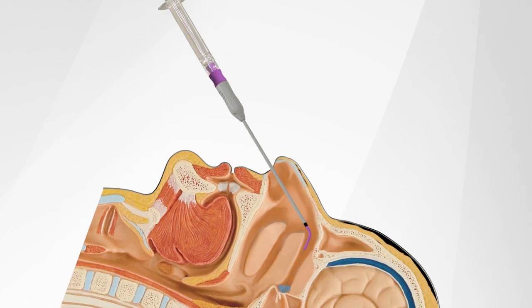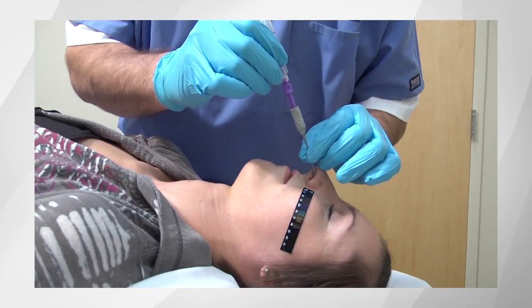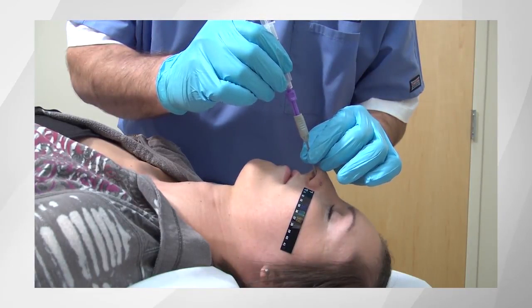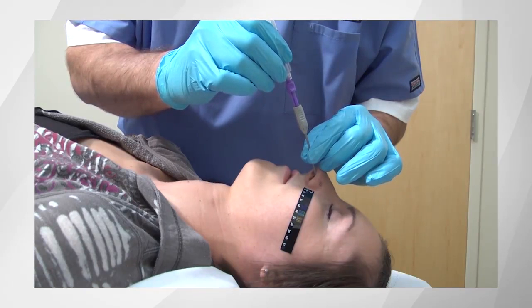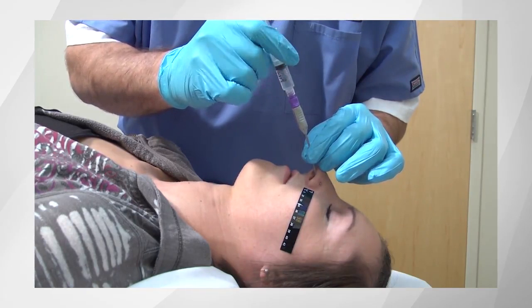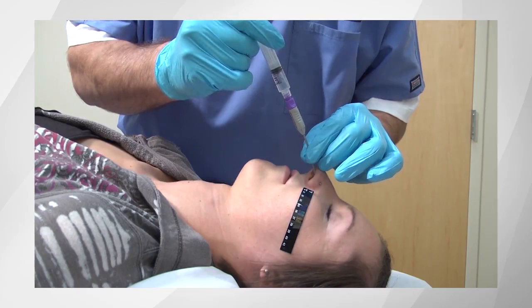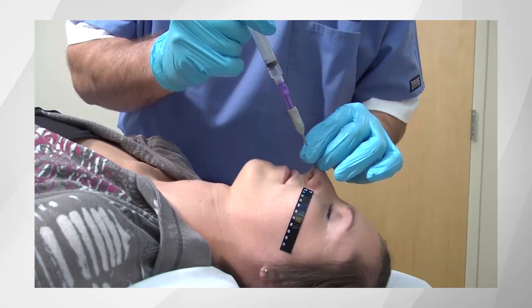At this point, inform the patient that you are now delivering the medication. A brisk, slightly pressurized delivery of injectate enhances procedural efficacy. If the patient sneezes or coughs, pause until they are done. Retract the inner catheter by separating the hubs. Pull the entire device back at least 1 centimeter. Then advance the device until nasal bone resistance is felt as previously instructed. Withdraw the catheter 1 centimeter. Deploy the inner catheter, and then begin injection when the patient is ready.